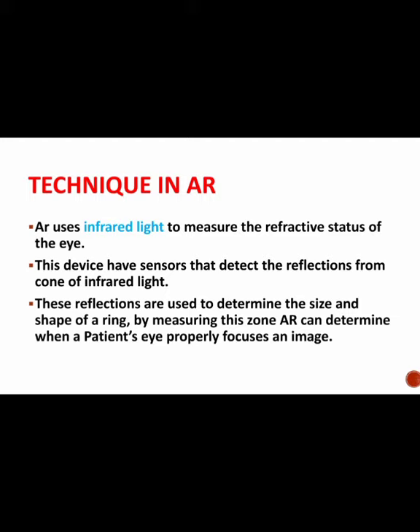We ask the patient to focus on the image that is displaying in the AR machine. When the patient properly focuses the image, we click in the AR machine, then the refractive error value of the patient is displayed on the monitor objectively. You can understand the technique very well by seeing the procedure of autorefractometer.